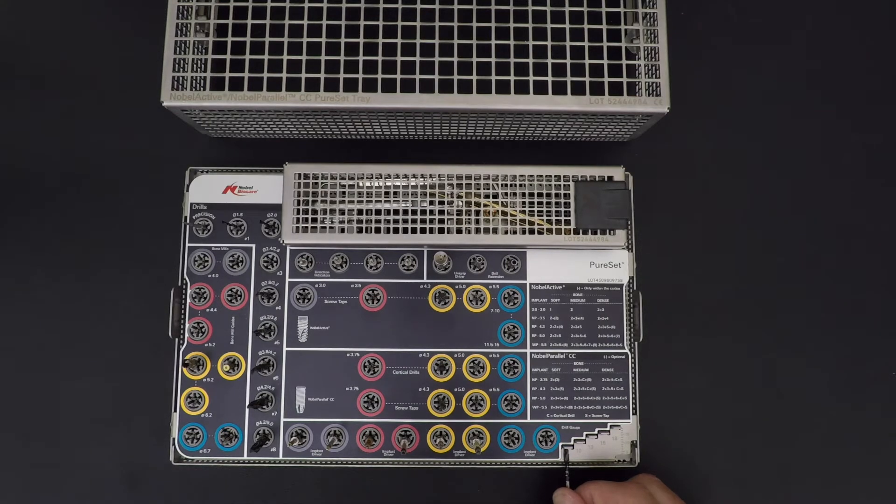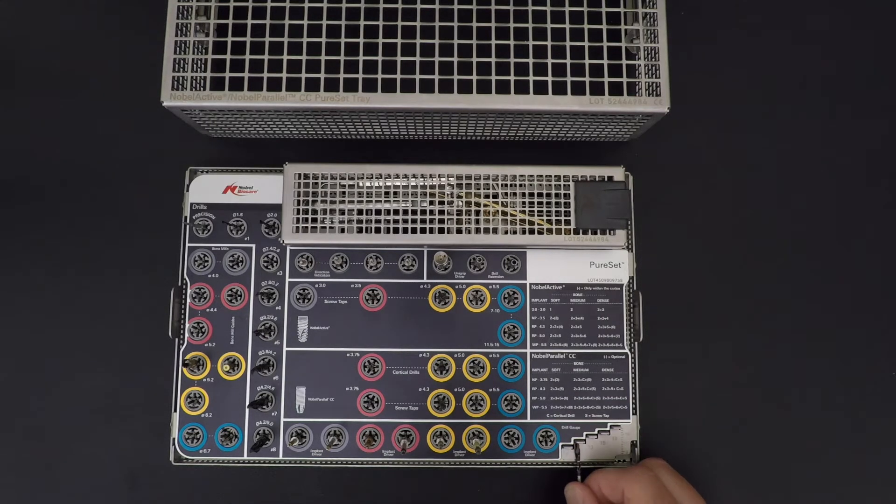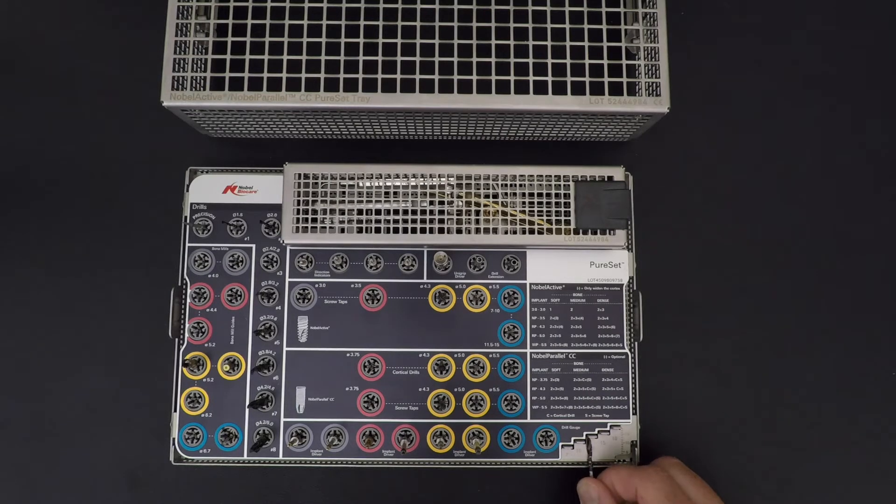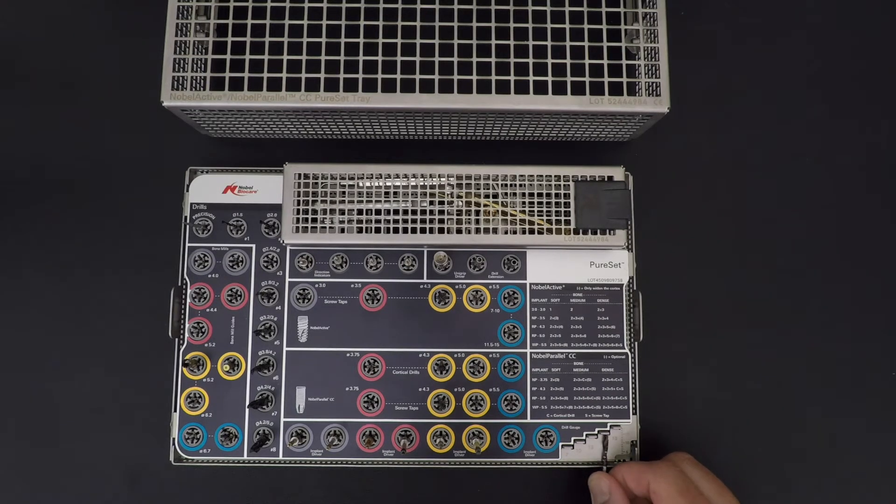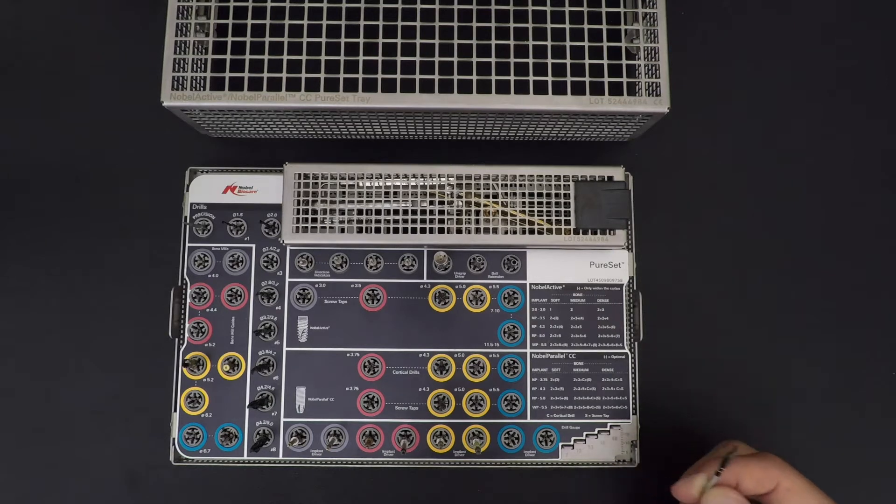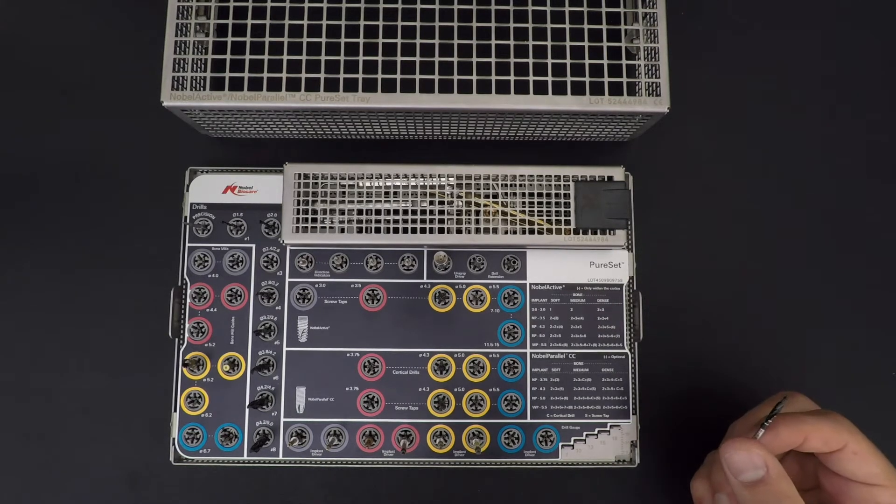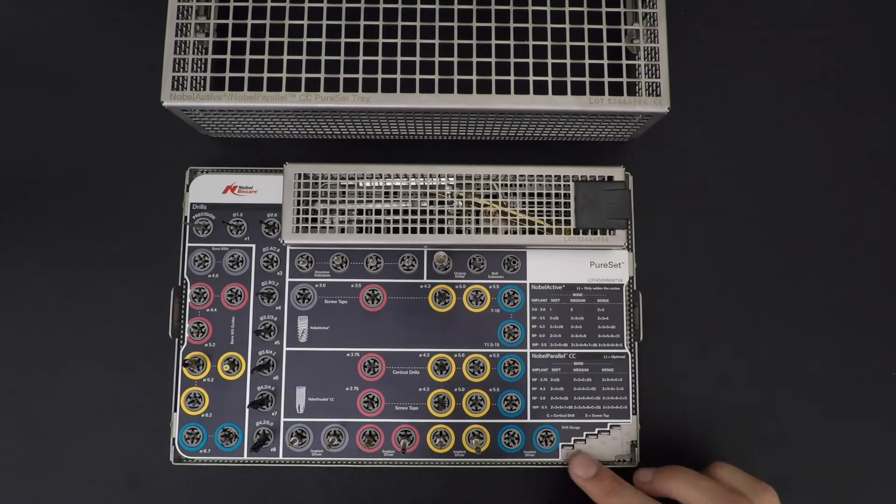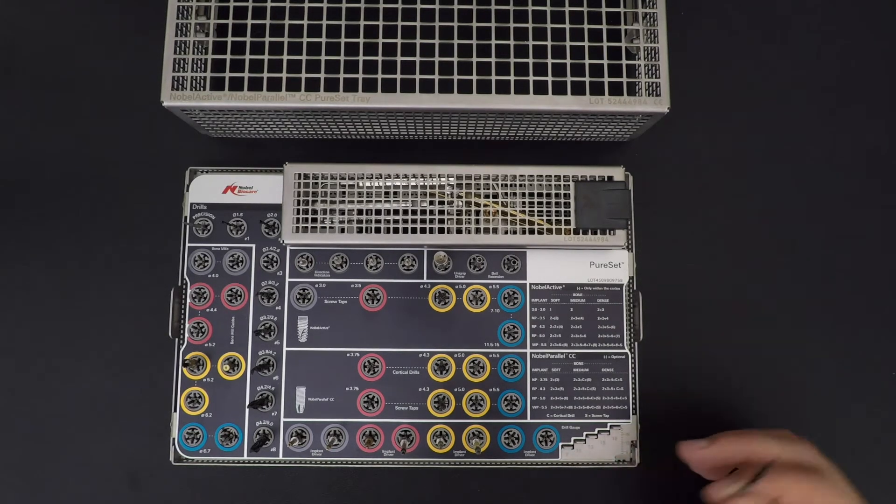The first mark is seven, second one is 10, this is 13, this is 15. I don't have an 18 - I don't have a fifth mark on that drill, so it's definitely a 7 to 15 drill. I know that my last mark is 15.